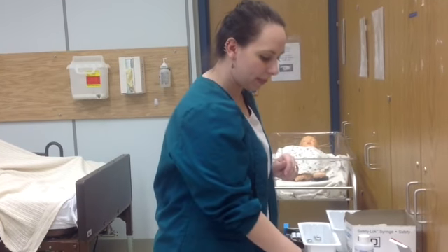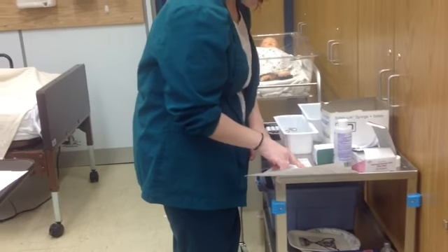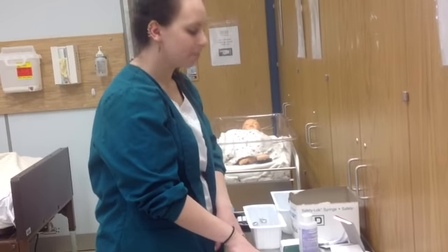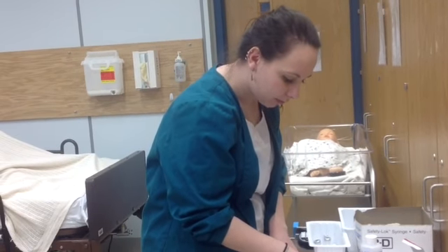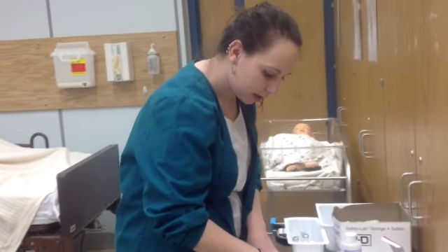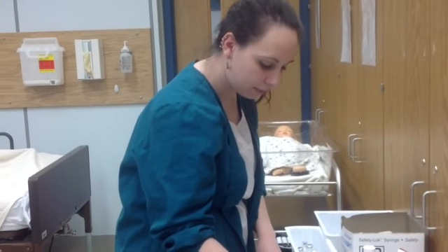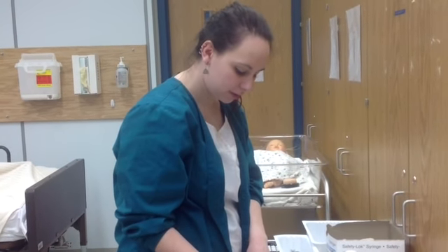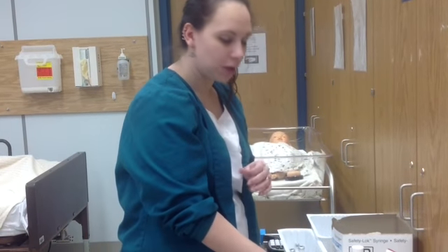My patient is Charles Wong. So I'm going to read his MAR. It says that he needs a penicillin IM injection at this time, 11 o'clock for today, 2/26. He's going to need it weekly, but we're going to concern ourselves with right now. The reason for it is due to an infection, and he's going to need the dose of 2.4 million units.